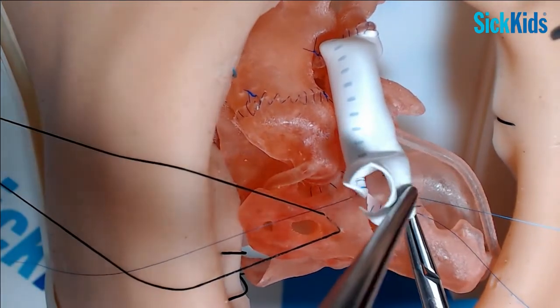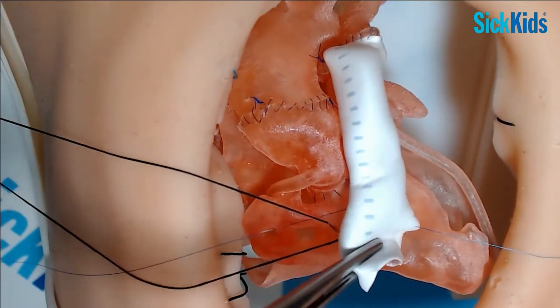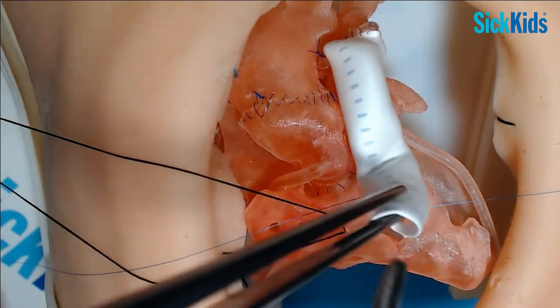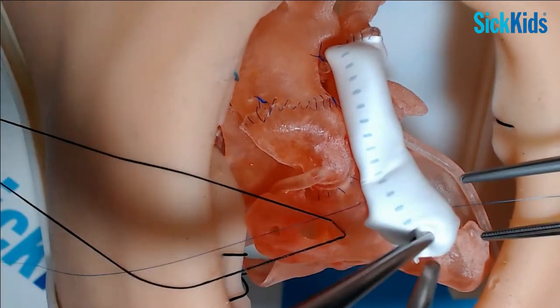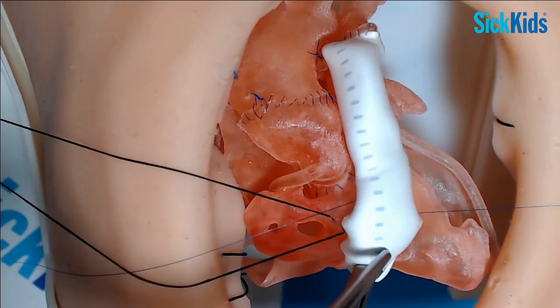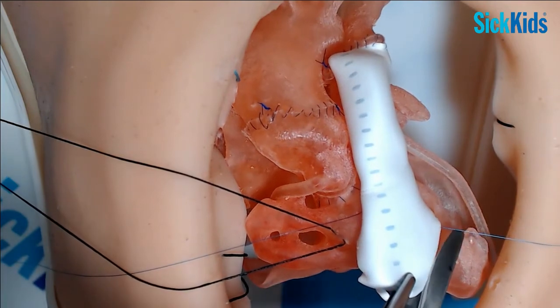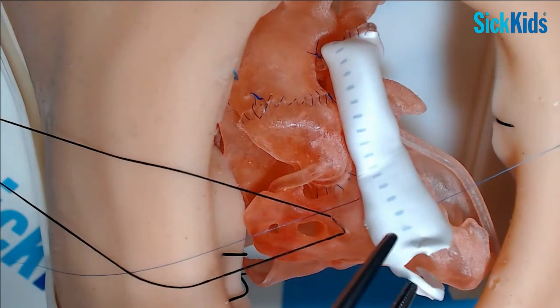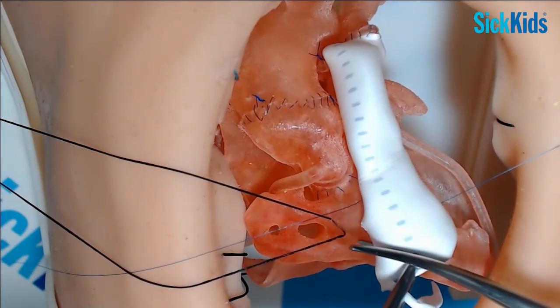Okay, so I'd stop there for a second. If you hold that, Emil, then you've got to get your conduit shape right. Put those scissors in. So you can look at your length, which is probably about right. Maybe ever so slightly, but I usually start in the midpoint. And then you want a nice sort of curved shape at the top here. And the same here. You don't want to make it too narrow.